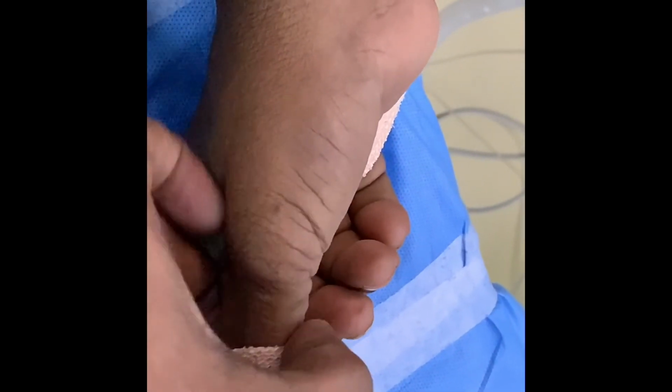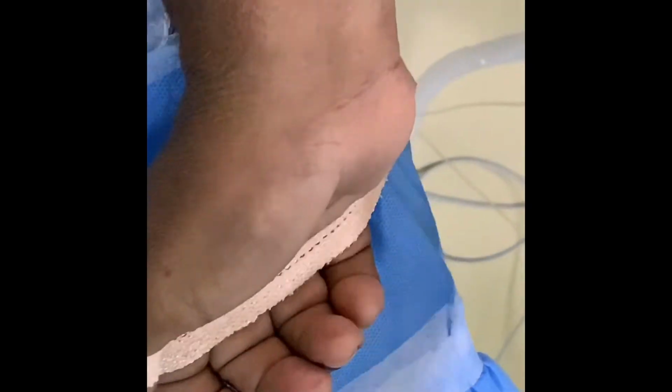First and most important step is positioning. As you can see, the performer is seeing to it that he is able to insinuate two fingers beneath the extension. If you keep the extension very close to the wrist, then the artery gets stretched, and even if you had punctured the artery, you would not be knowing that you have punctured the artery. So it's always better to be able to insinuate two fingers between the extension and the wrist. The other is proper fixation with plasters so that the hand is very stable and does not slip.